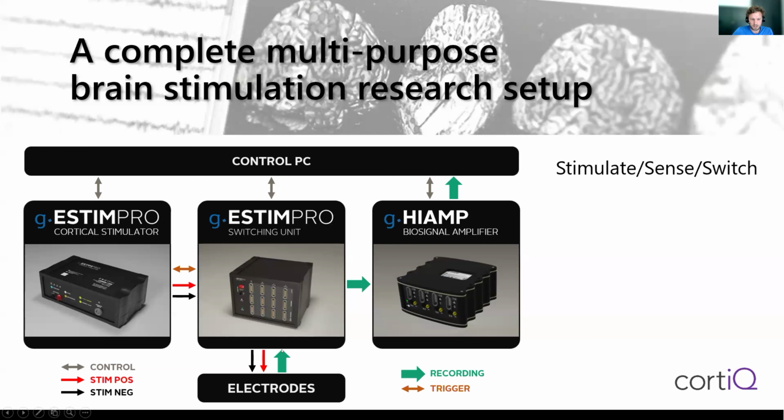Notably, it's not possible to record the stimulation channels at the very time of stimulation, but it's possible to record them immediately before and immediately after stimulation. And by immediately, I'm talking about milliseconds. So depending on the setup, 4 to 6 milliseconds we're talking about here.